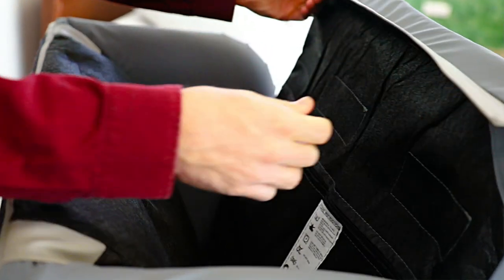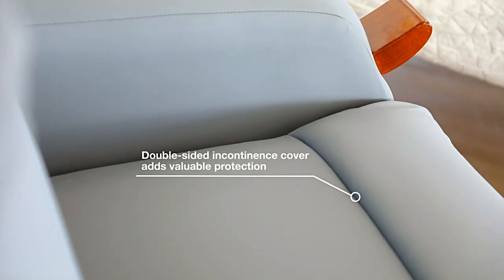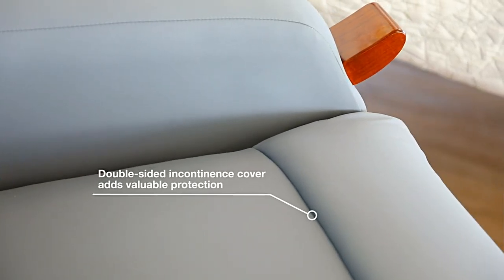The removable seat and back cushions make the chair easy to wash and maintain, and the double-sided incontinence cover adds valuable protection.